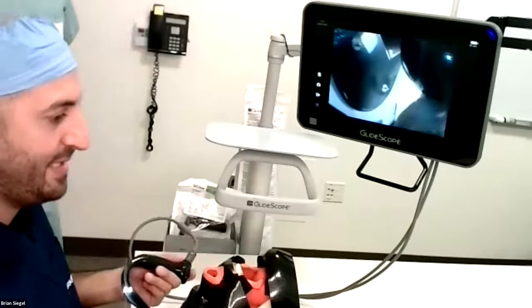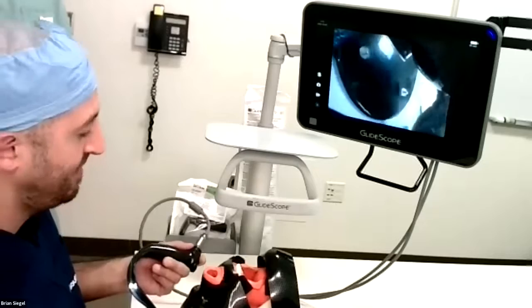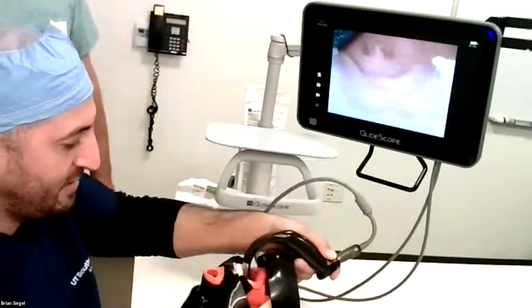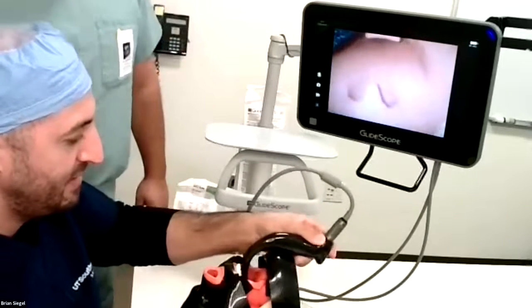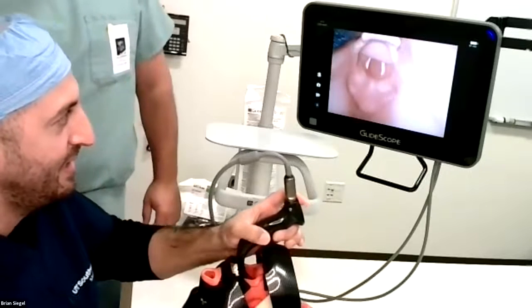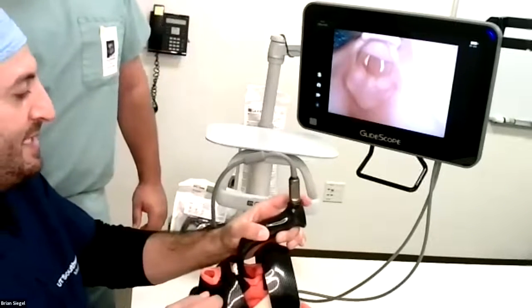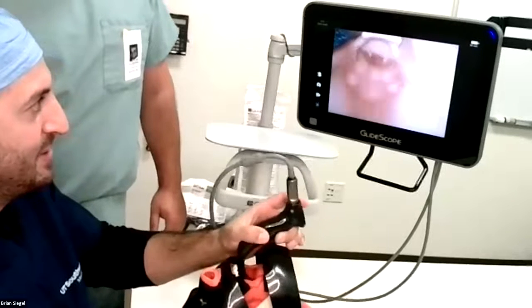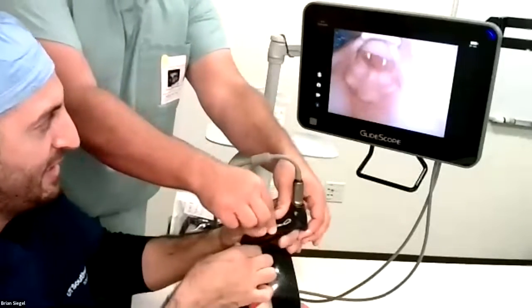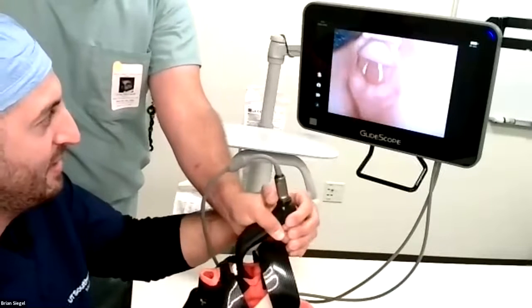Now I have my mannequin here, who we affectionately refer to as Darth Vader. I'm going to use my GlideScope blade. We're going to insert midline on the mannequin — it always makes it tough when you're trying to intubate a mannequin — but there's my epiglottis and my view of the glottic opening. Now that I have the view I like, I can position it however I want. I'm going to ask my assistant to take over and I'll move his hand exactly how I want.